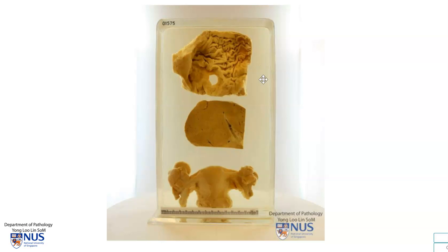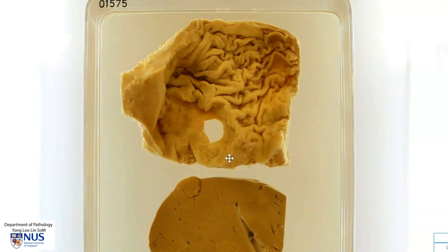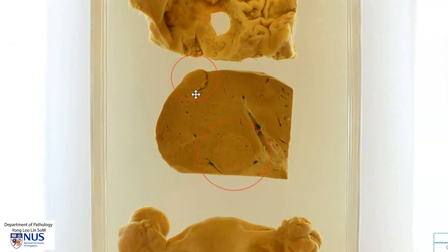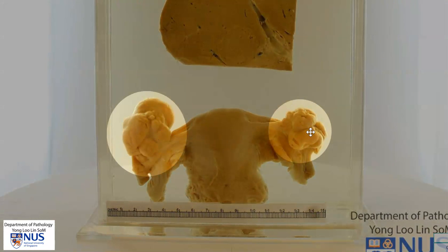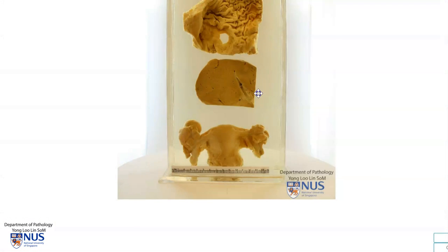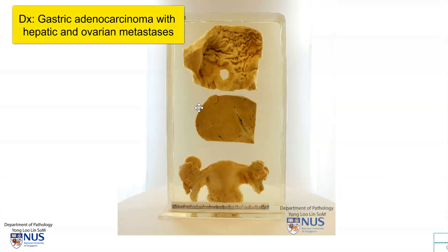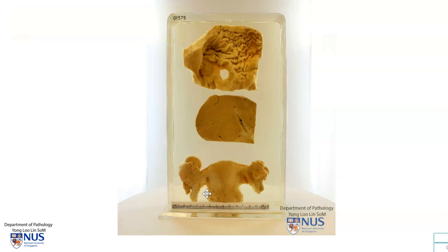Finally, just to summarize — this was the specimen we saw initially. We have a primary adenocarcinoma in the stomach with a very irregular ulcer with heaped-up edges, liver metastases with two nodules of metastatic tumour in the liver, and bilateral enlarged ovaries. This is an instance of gastric adenocarcinoma with both hepatic metastases as well as metastases to bilateral ovaries. Thank you.